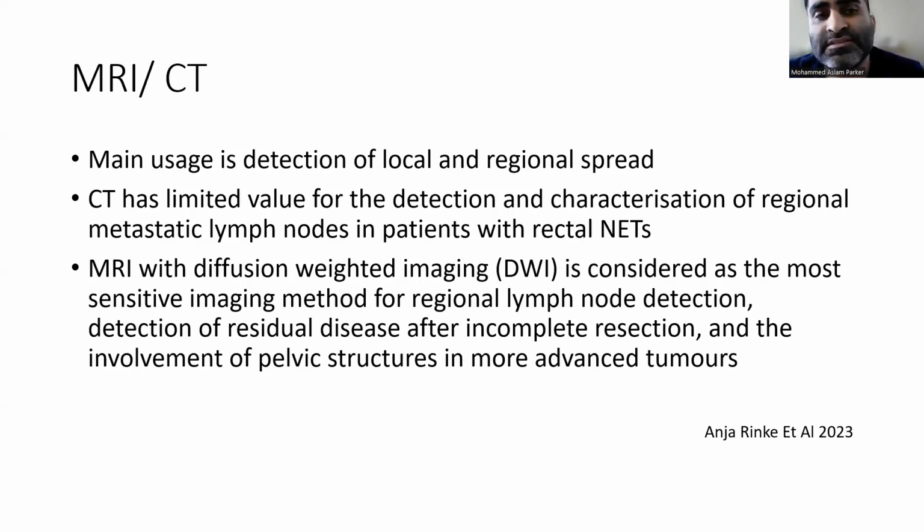So your MRI and CT, your main usage is detection of local and regional spread. CT has limited value for the detection and characterization of regional metastatic lymph nodes in patients with rectal NETs. MRI is considered as the most sensitive imaging method for regional lymph node detection, detection of residual disease after incomplete resection, and the involvement of pelvic structures in more advanced tumors.